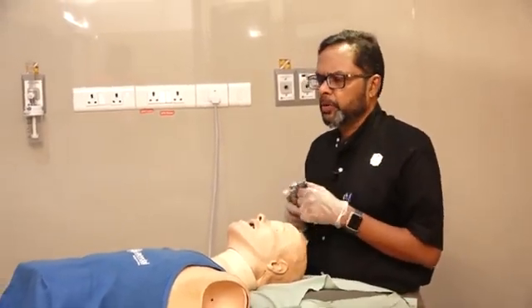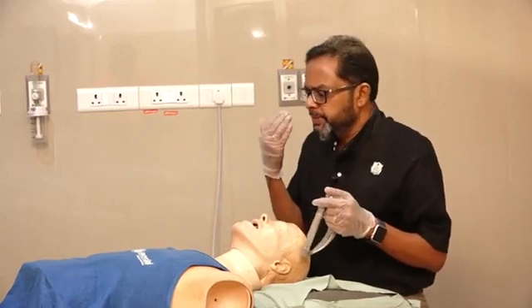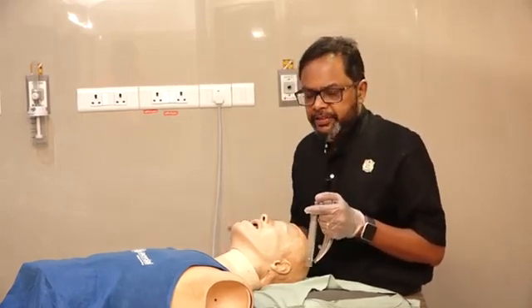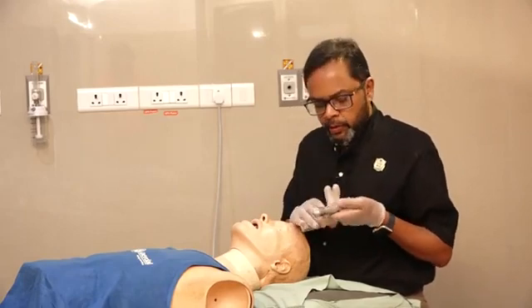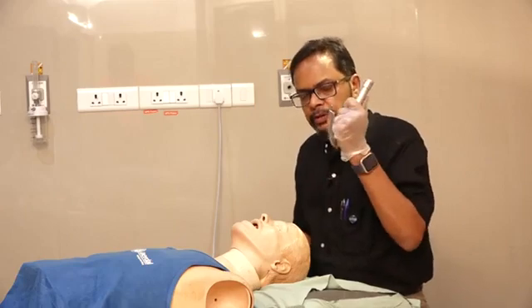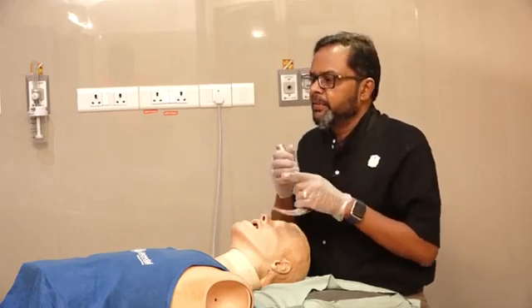Before the process of intubation, the patient should be unresponsive, or if the patient has reflexes, you should give adequate sedation or paralytic agents. Remember, always hold your laryngoscope with the left hand — never with the right hand.